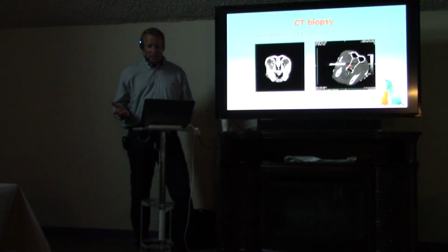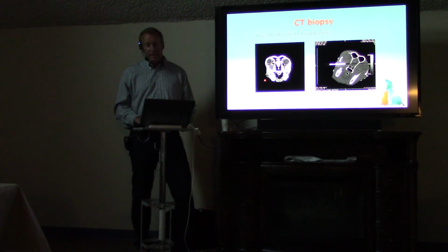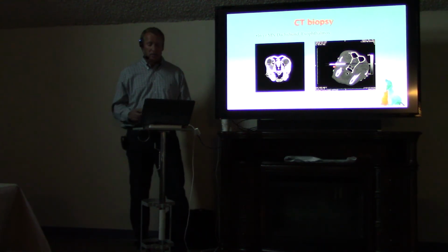It doesn't always have to be the thorax. This is a dog with exophthalmos, and we identified a large retrobulbar mass here in the region of the zygomatic salivary gland, and so we were able to do a CT-guided aspirate of that and make a diagnosis of sialadenitis as opposed to neoplasia, and this dog responded well to antibiotics and steroids.